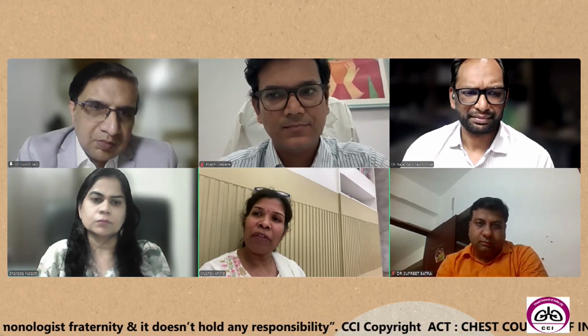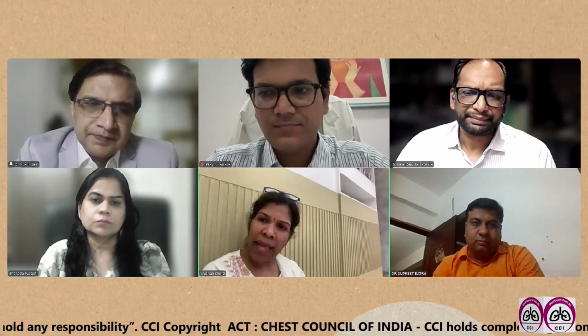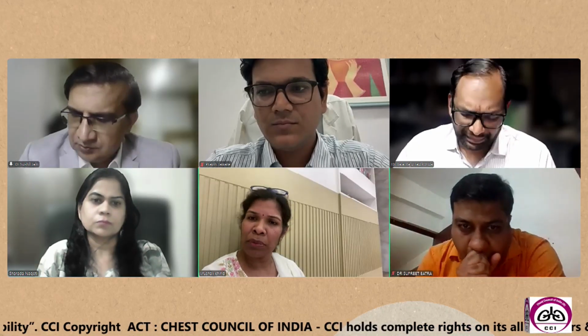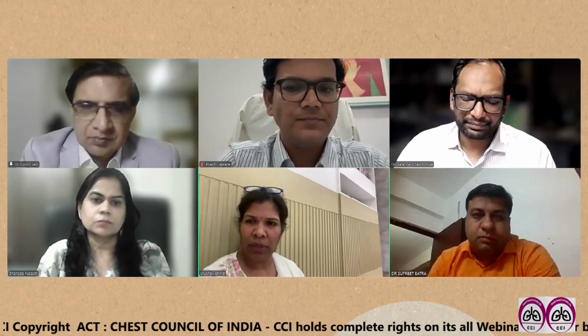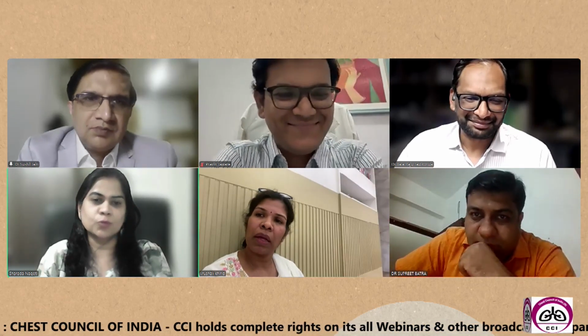But now considering flow cytometry, if you're using a 22 gauge needle, which most of us are using, I believe 19 gauge is no longer available. No longer available, 21 is also not available. So in that case, would you prefer flow cytometry over the intranodal forceps biopsy or the cryo? I always prefer a cryobiopsy because that gives more tissue.